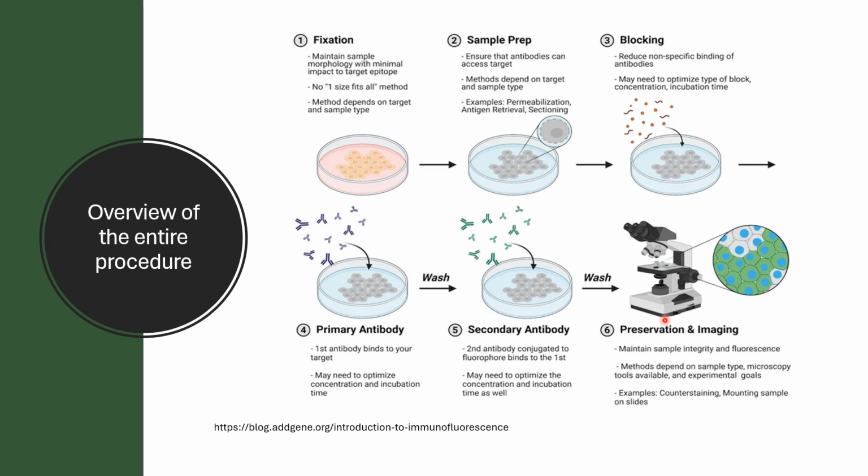A mounting medium is used with anti-fading agents for mounting the sample to preserve the fluorescent signal. Imaging. The fluorescent microscope with appropriate filters examines the sample. This helps visualize the fluorescent signal emitted by the secondary antibody bound to the target protein. Different fluorophores emit different colors of light, allowing for multicolor imaging.